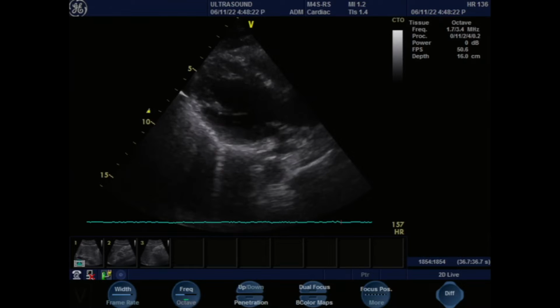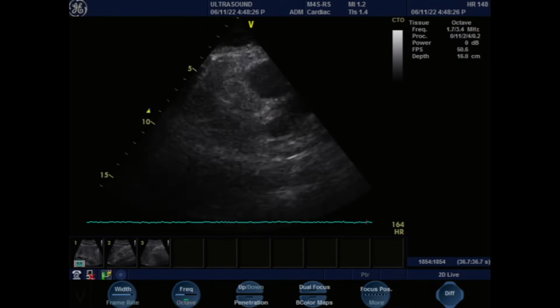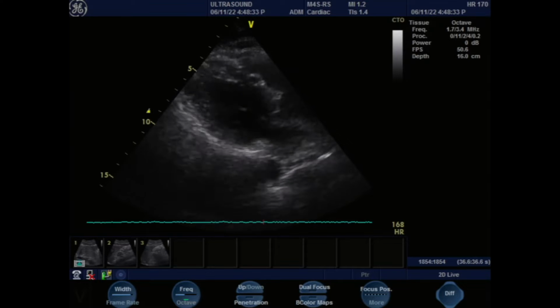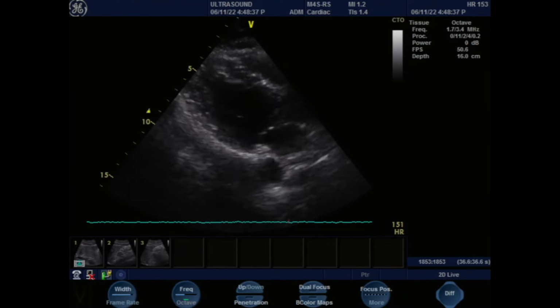And remember, the heart is a cavity. Can you tell about the cusps there? Yeah, not yet. We can't tell the cusps here. So here, this is the mitral valve that you're looking at. Okay? So this is the mitral valve, this is the aortic valve. And you can see that the mitral valve is joined with the aortic valve, right?